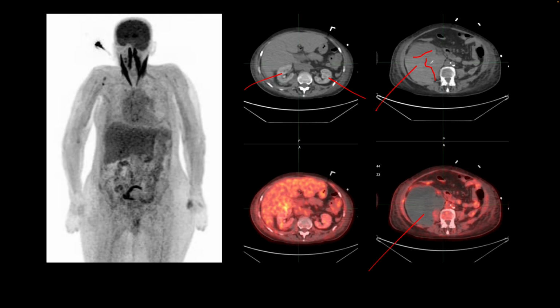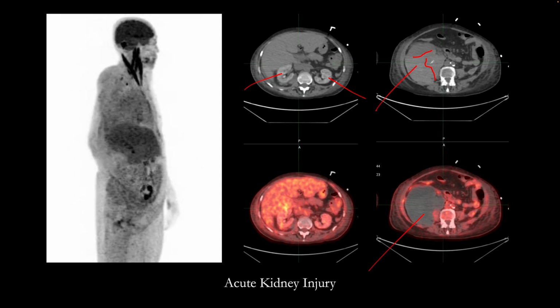And so there are things that you can pick up on FDG PET-CT scans that are outside of oncology, and these findings are important to pick up and report.